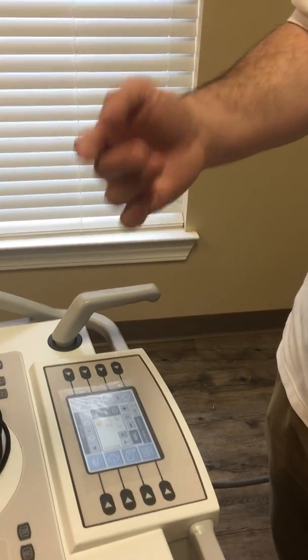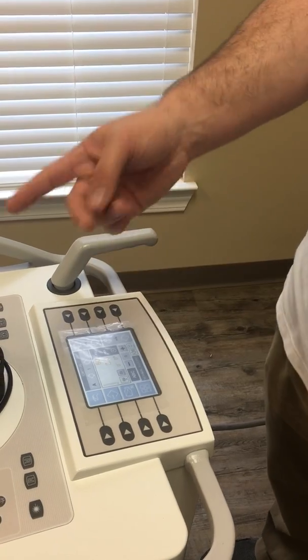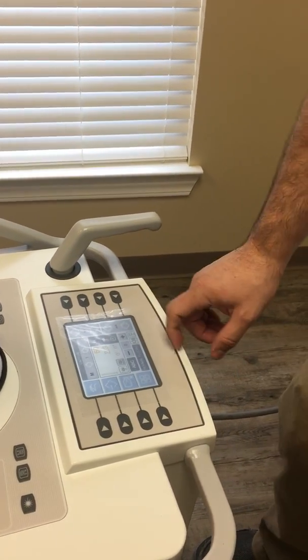Sudden, it's like if you bump that button or you lean over and your apron hits it or something, every time you fluoro, it saves an image, and you're like, oh my gosh, we got 100 images in this study. What the heck's going on? It's probably that button.